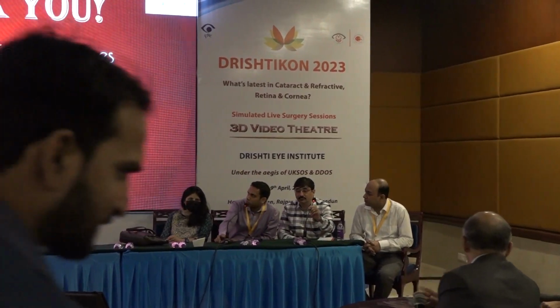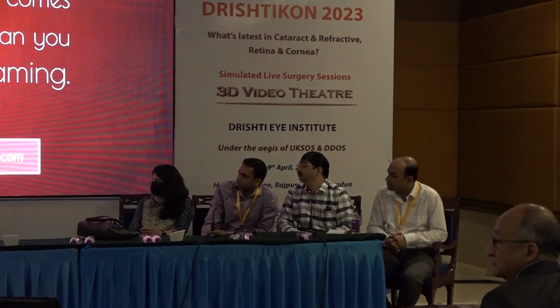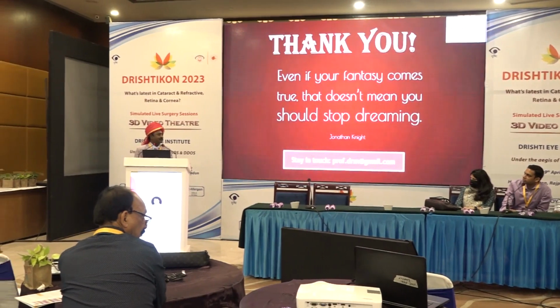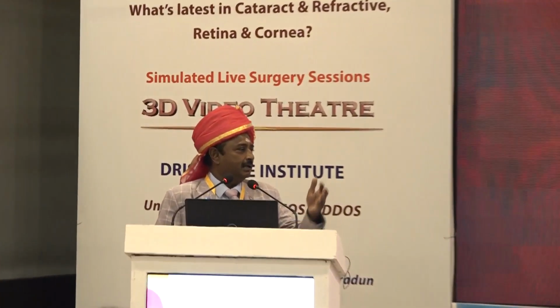Sir, do you routinely use a two-port chandelier system for all your diabetic TRDs? No, as I said, I have a game plan. I decide the day before what I want. But anyway, in the OT, everything should be ready. That's why I tell them I will keep changing my plan on the table. So if I plan a chandelier and I don't do it, I tell the sister, don't question me. The idea is to have a game plan. It's an algorithm which Steve Charles has given in his book, but it doesn't work exactly like that. So you have to have the algorithm and use it like a computer on the table.